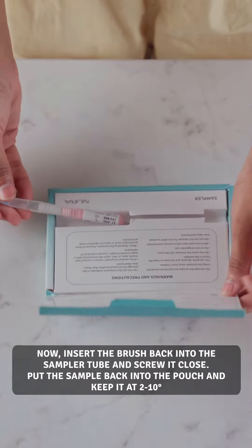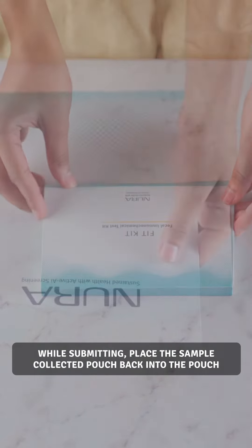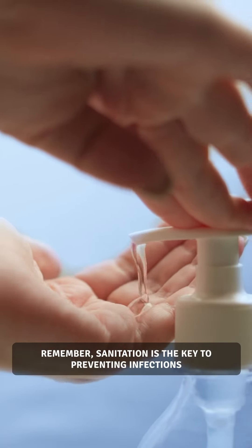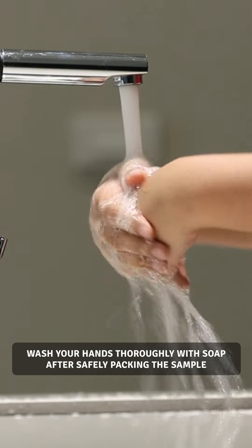Put the sample back into the pouch and keep it at 2–10 degrees Celsius. While submitting, place the sample-collected pouch back into the outer pouch. Remember, sanitation is the key to preventing infections — wash your hands thoroughly with soap after safely packing the sample.